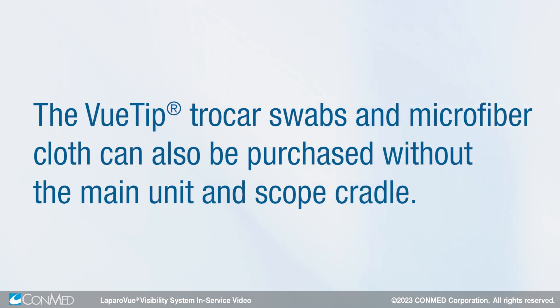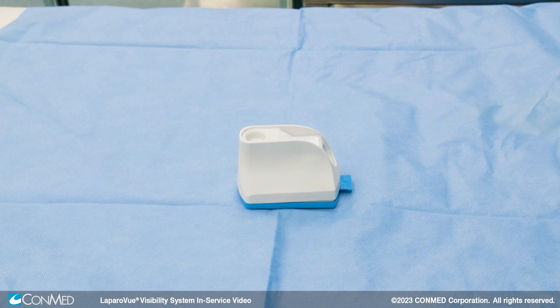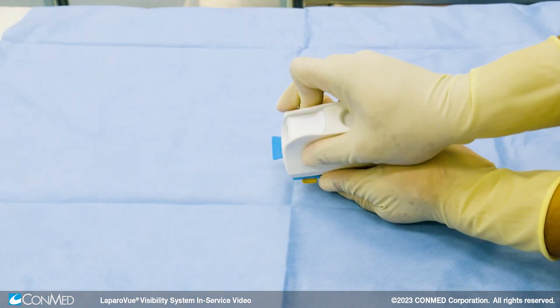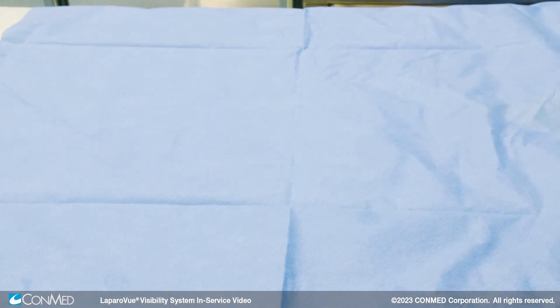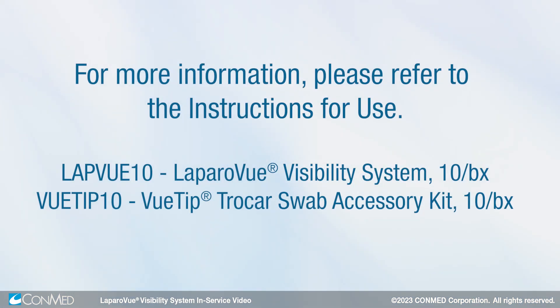The view tip trocar swabs and microfiber cloth can also be purchased without the main unit and scope cradle. After the case, the unit should be disposed. Batteries can easily be separated from the unit by removing the top housing and then the internal plastic housing. For more information, please refer to the instructions for use.